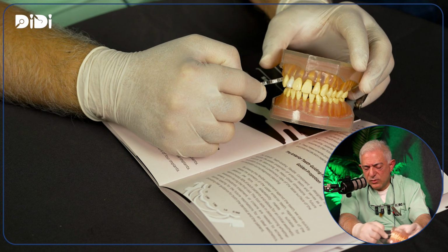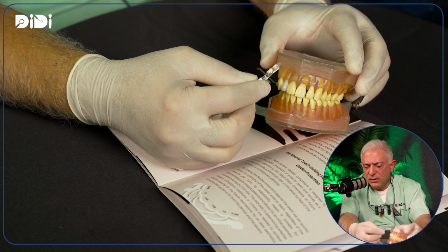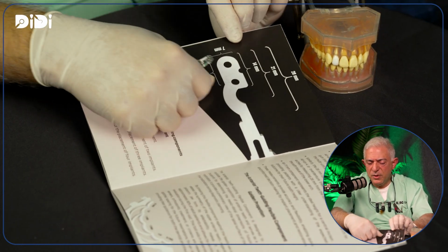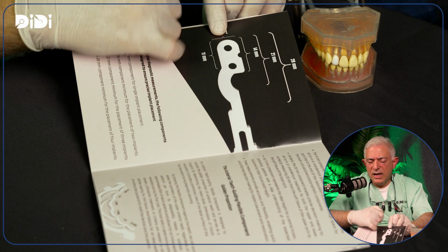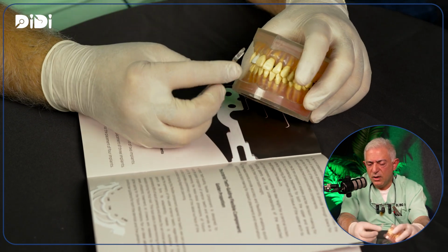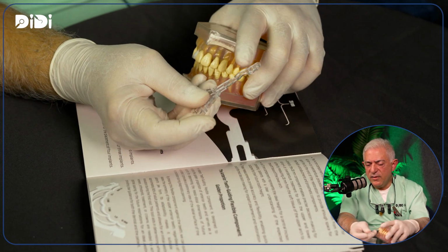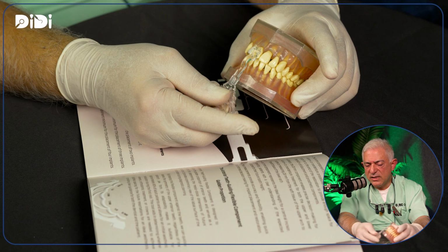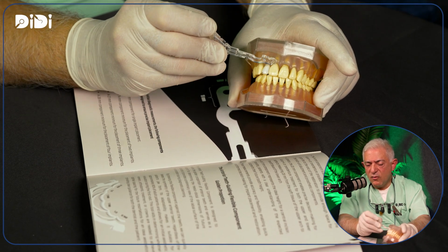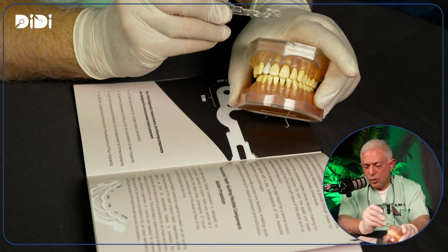Why is the neighboring tooth looking shorter, longer? So you have an 11 millimeter tip here. If you see this catalog, from here till here, you have 11 millimeters. So as soon as the patient sits on the dental chair, you hold this against the central. And if exactly this central is 11 millimeters, that means you have an average height of visible central incisor in this patient. They are not square or too long.